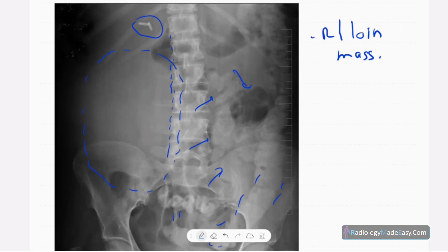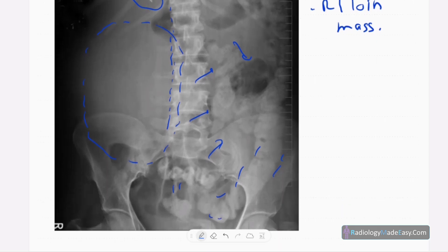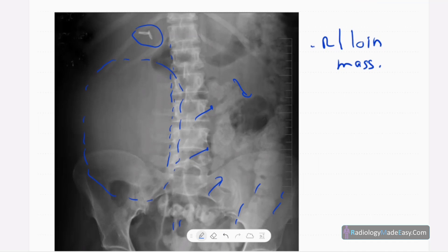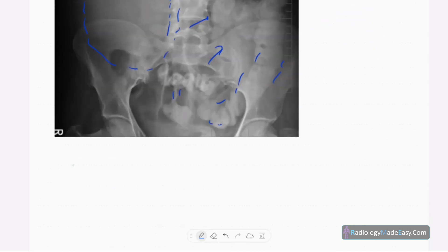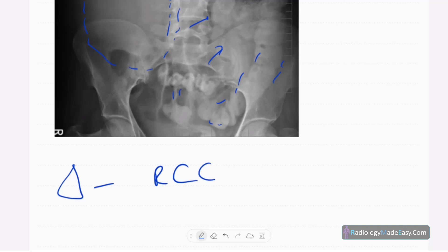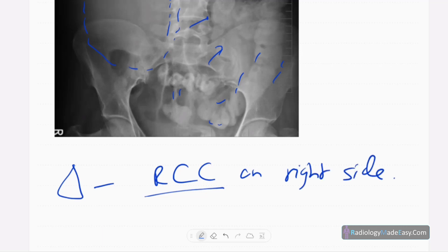Since it's a mass, you have to look for metastasis. When you suspect a renal or right loin mass, look at the vertebral column closely — the pedicles, spinous processes, and pelvis — for any bone metastases. In this case, there are no bone metastases, and the diagnosis is renal cell carcinoma (RCC) on the right side.